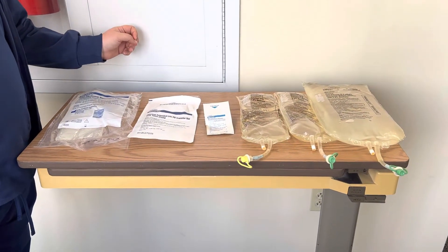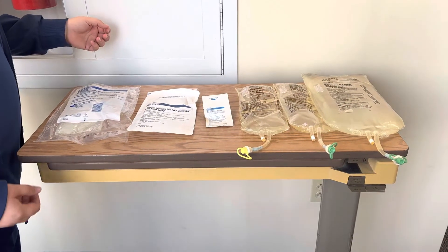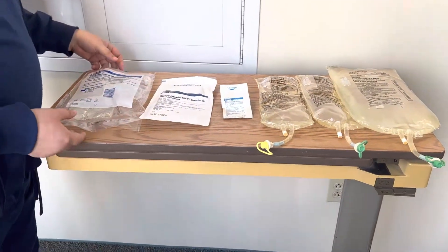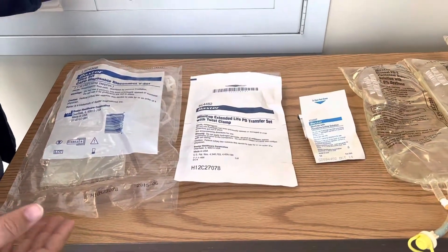Hello everyone! Today we're going to be talking about how to do peritoneal dialysis and how we need to set it up — all the things we need to get and then how to actually put everything together. So when you're getting ready for peritoneal dialysis you want to have some of these products.